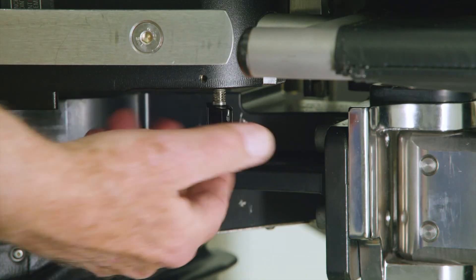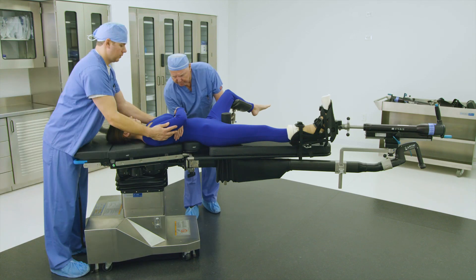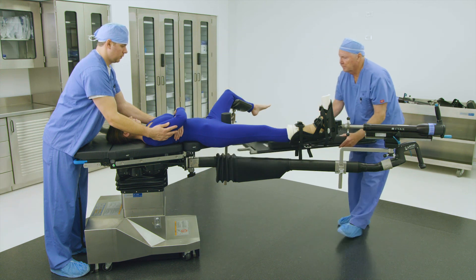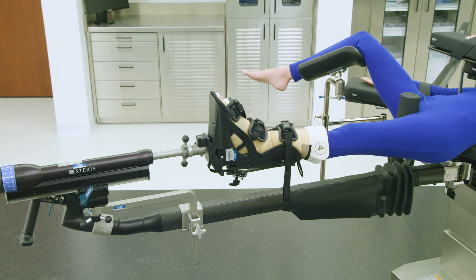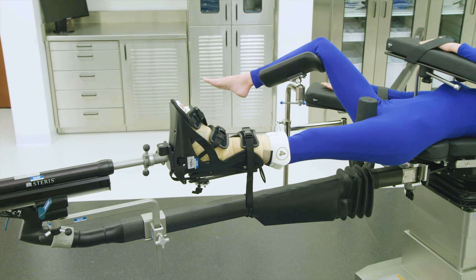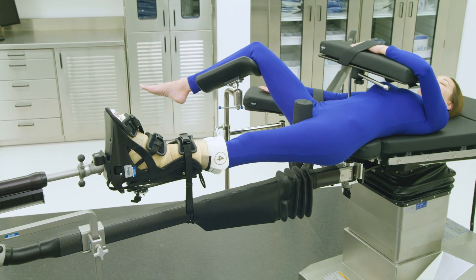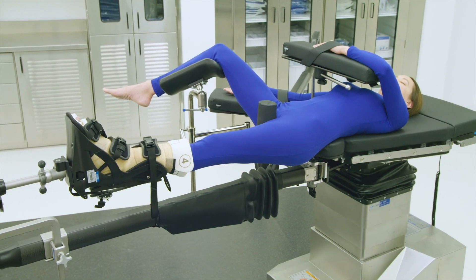Unlock the two knobs under the left and right side of the patient transfer board's prongs, found right above the abductor spar rosettes as shown here. Remove the patient transfer board and return to storage. When setup is complete, the Steris OT Table should look like this for the intended procedure. Refer to the OT Table Setup Guide, pages 8-21, for written instructions on setting up the table for this orthopedic case.